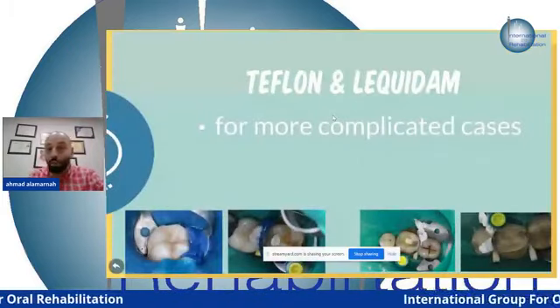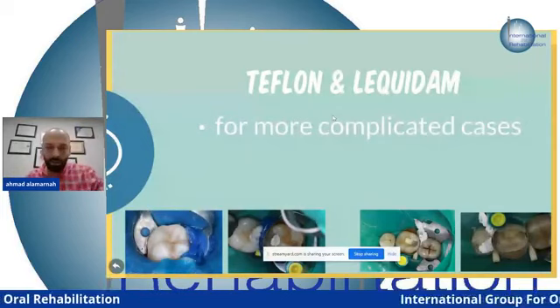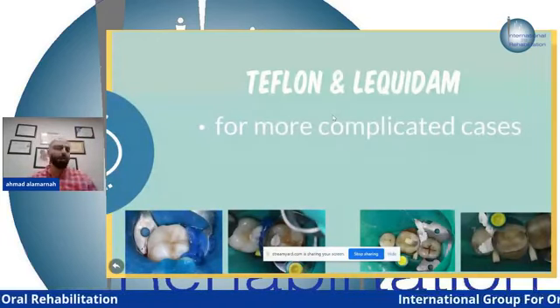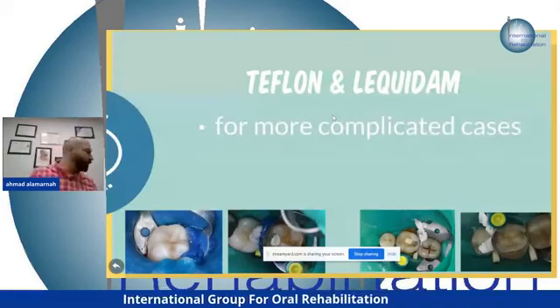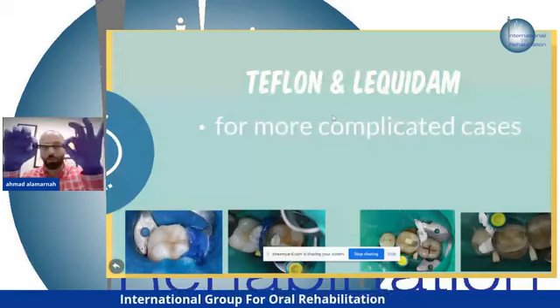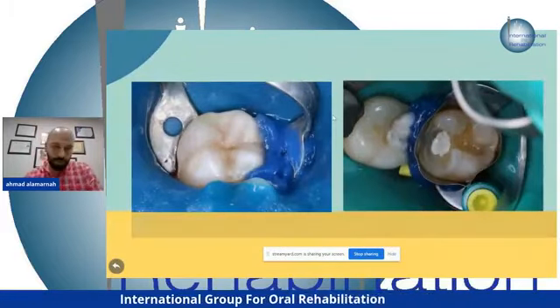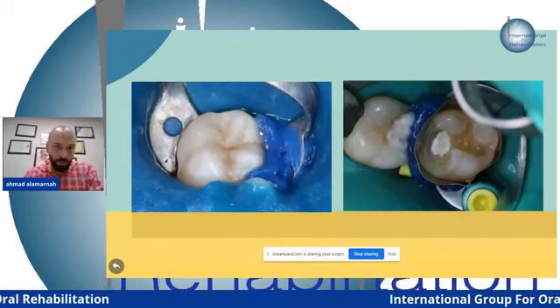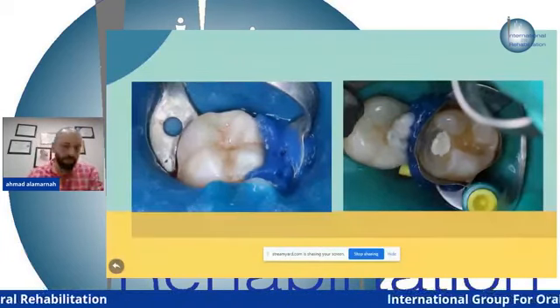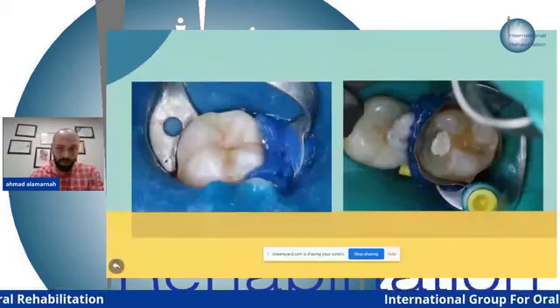And also we can use Teflon and Liquidam. What's Teflon? It's the normal tape that we use for the pipes in our homes. And the Liquidam is any liquid composite that maybe comes with the whitening kit. Maybe you have a cheap one, I don't know if you see me or not, but this is a cheap liquid or flowable composite. I use it for isolation also, and for creating some ideas inside the patient's mouth. For this patient, I used only the W8 rubber dam clamp and isolated only that tooth. I don't know why, because it's the 7, maybe, and it's class 1. I have some leakage here, so I use the flowable composite, the Liquidam.